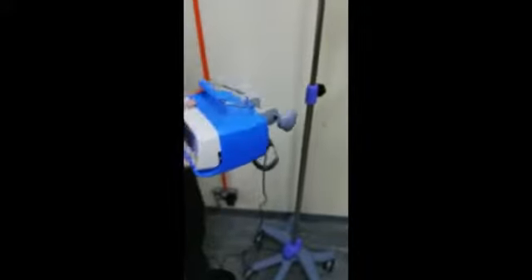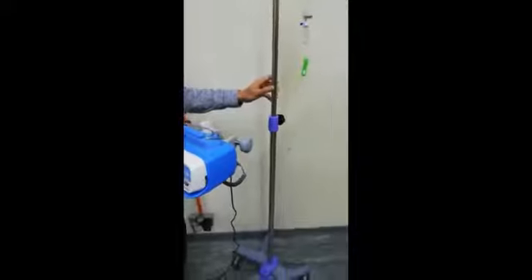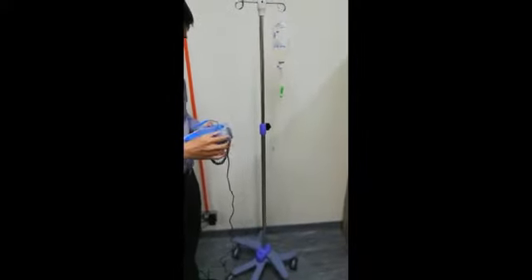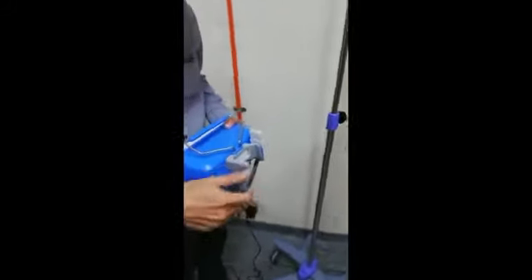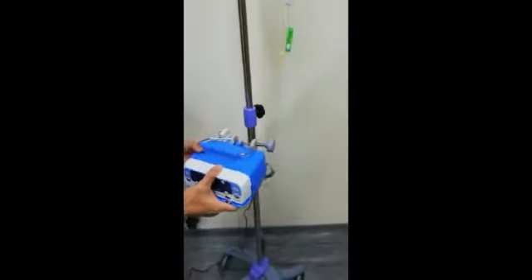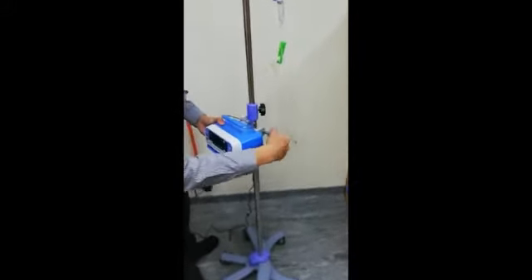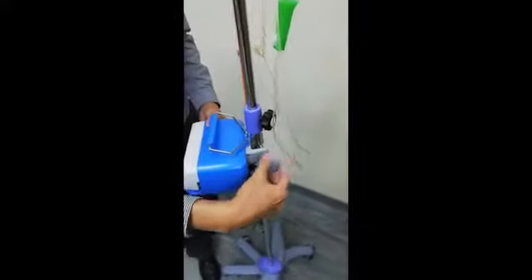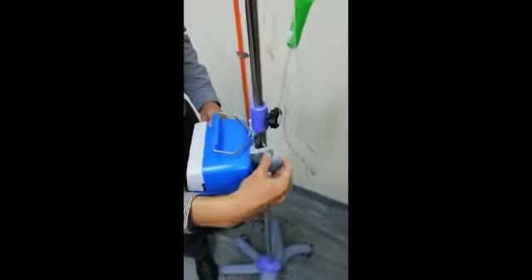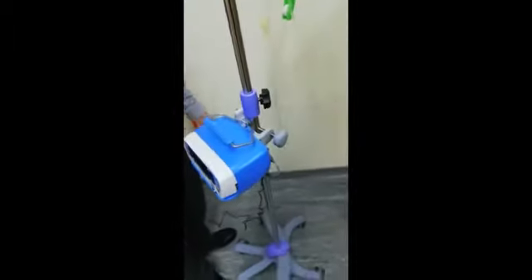I'll show you how to fix this pump on the hospital bed IV stand. The good point about this pole clamp is that the pole can be as big as this size. In this case, I'm mounting on this stand. I'll just show you. Just mount like this. Make sure this screw is tight on the pole. This is how it looks.